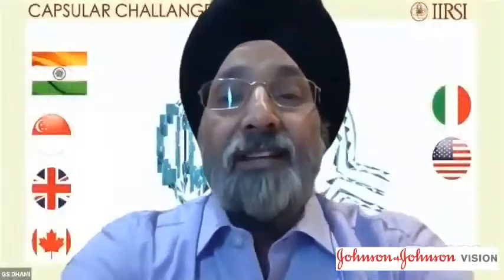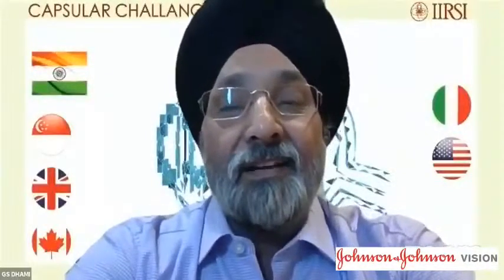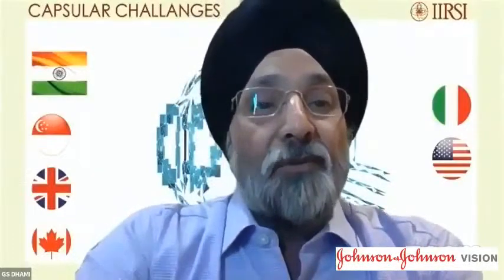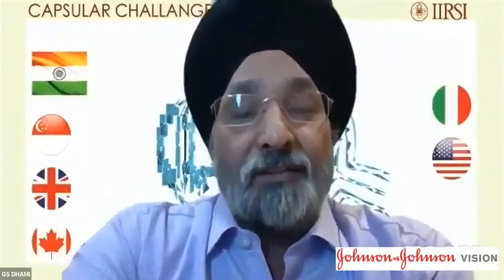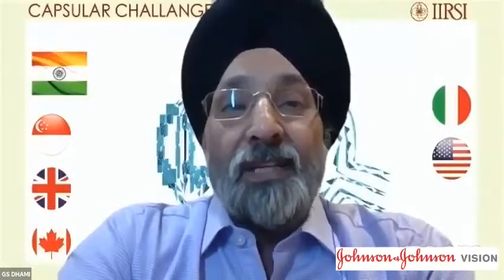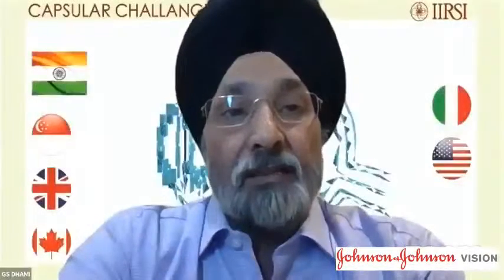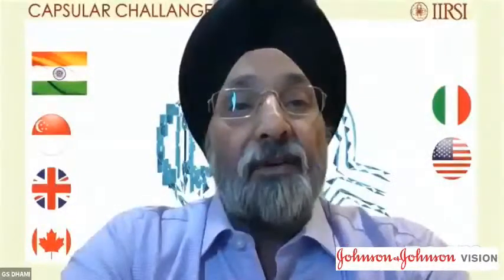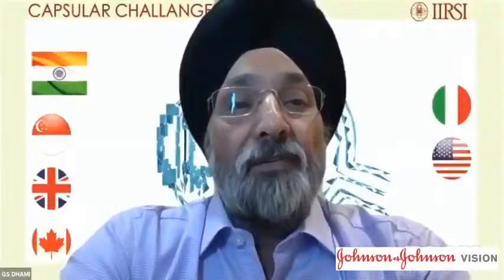I saw excellent videos of Dr. Naveen. Really marvelous. But I'd like to know the panel's view regarding retrofixation of iris claw lens. We are very fond of it. It's a few second job. A good Artisan lens after a good vitrectomy does very well, with good centering and no complications. We are really doing that. The Yamane technique and others, glued IOLs, but the easiest and the fastest way we can do is the retrofixation of the iris claw lens.